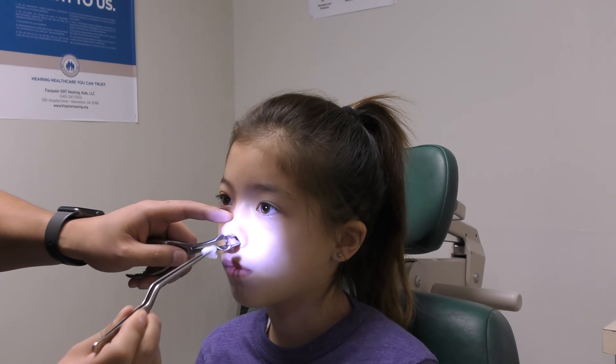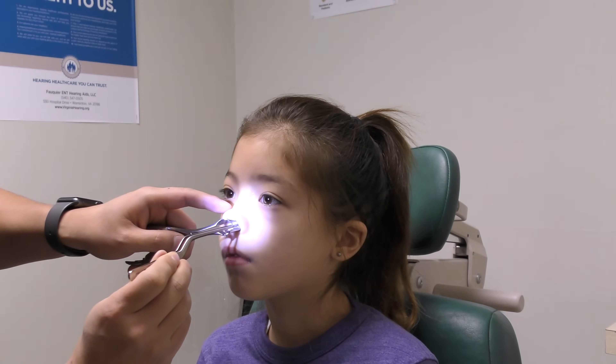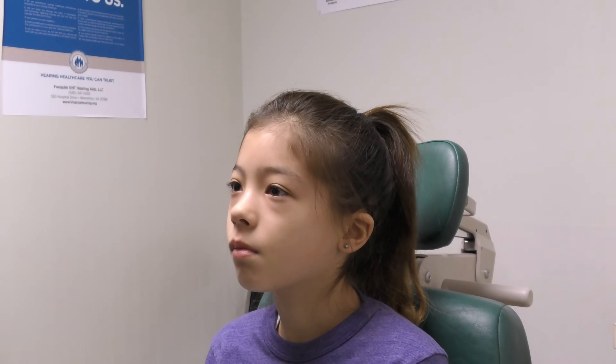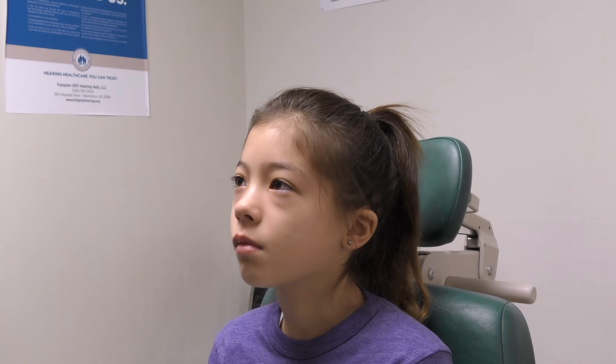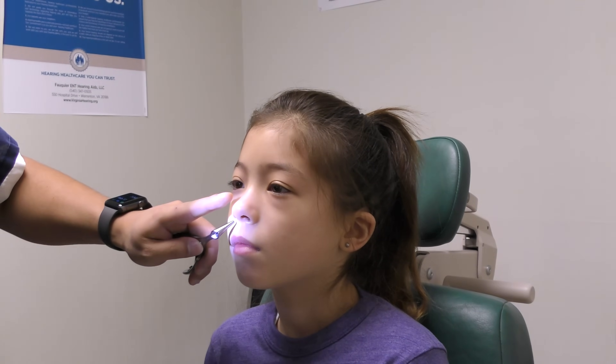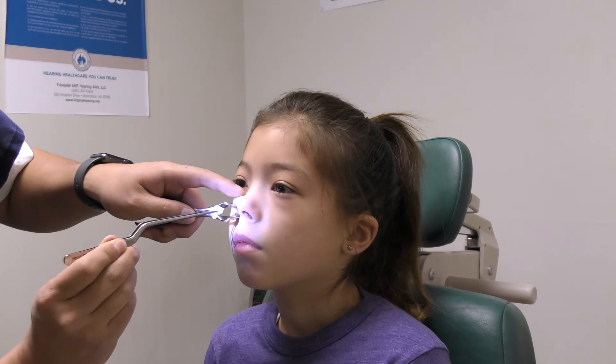Nasal cautery can be performed without sedation in cooperative children, typically starting around age 5 years. Usually silver nitrate cauterization is tried first before other more invasive methods of cauterization are utilized, including electricity.